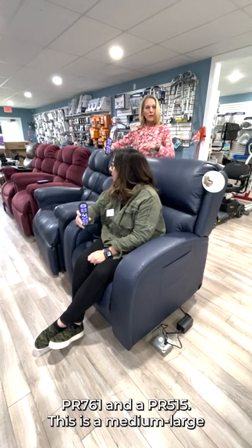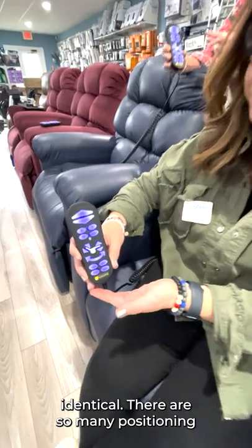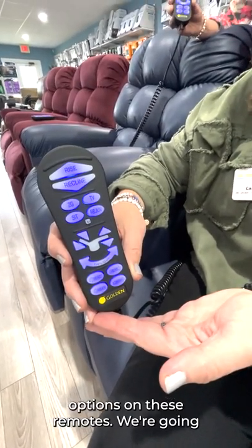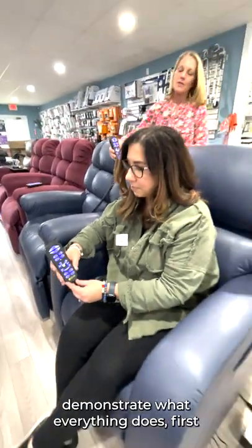This is a medium-large chair. We want to go through the functionality of the remote for these chairs, which are identical. There are so many positioning options on these remotes. We're going to start with Kara demonstrating what everything does.